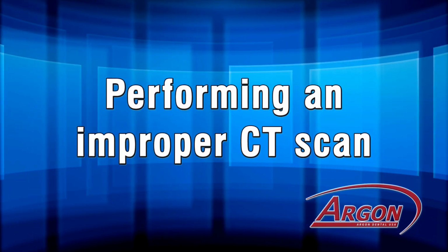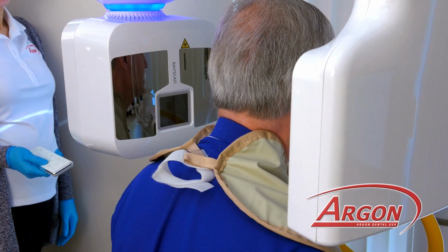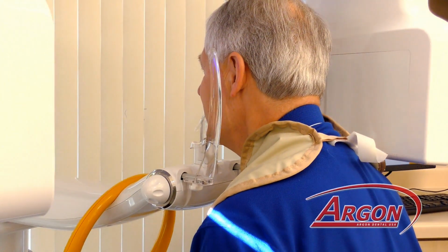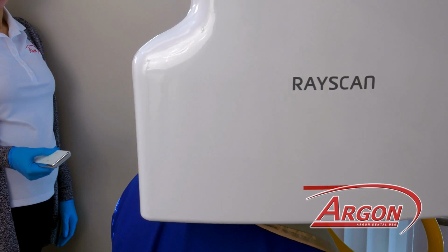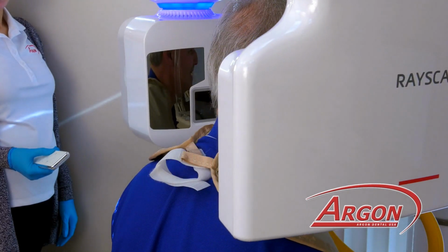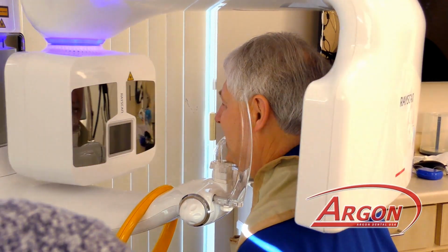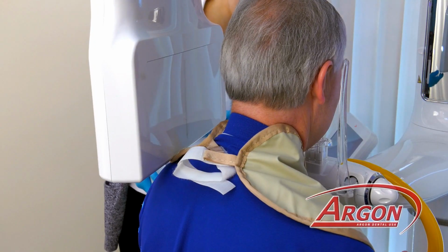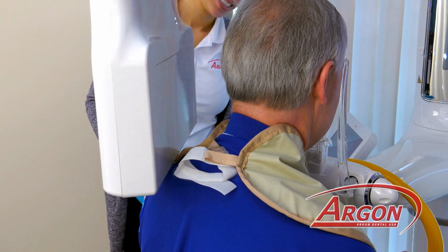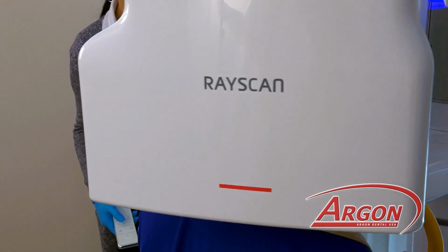This is an example of what not to do. If the sensor is positioned improperly, you can see it could hit the patient. If it does disrupt the patient, it would allow that head to move, giving an improper CT. We will display and show you what this looks like shortly. Always adjust the sensor so that it does spin around the patient without any touching or movement of the patient. As you can see, we demonstrated that prior to the CT.